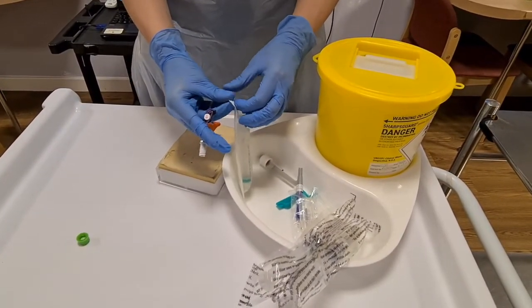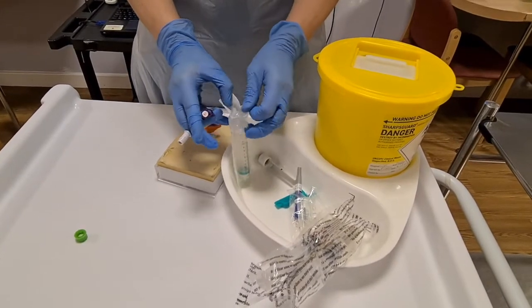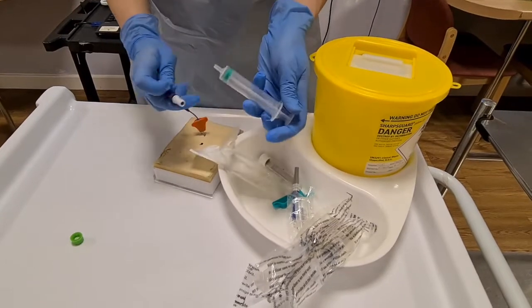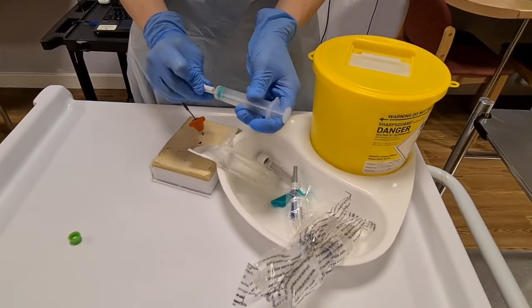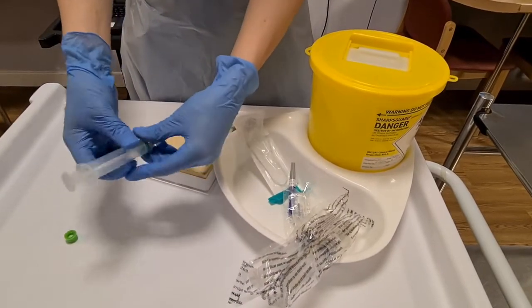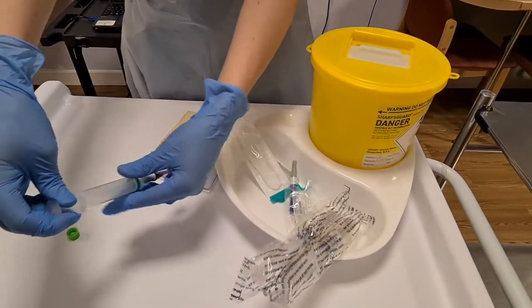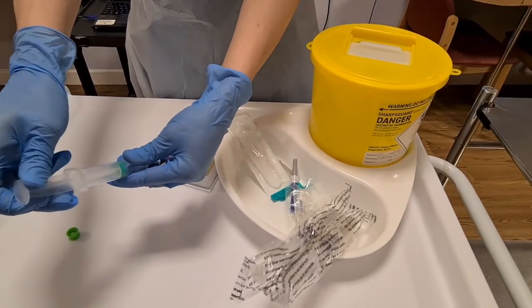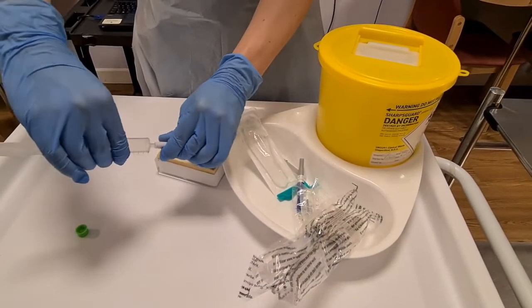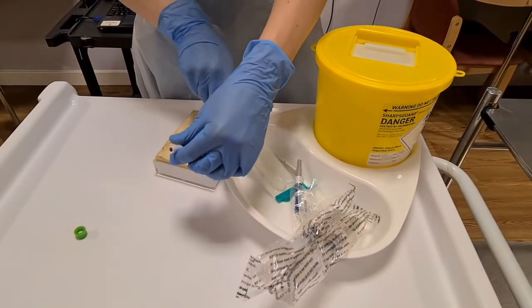Never use a smaller size syringe than a 10ml syringe, because that causes too much pressure on your PICC line. So you connect it on, and then what you want to do is unclip and aspirate 10 mils of blood. Then you take your 10 mils of blood and you throw it away.